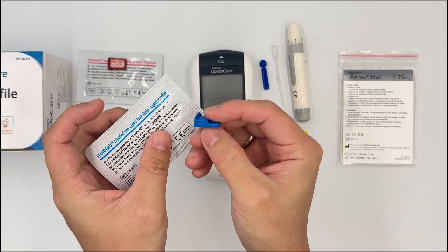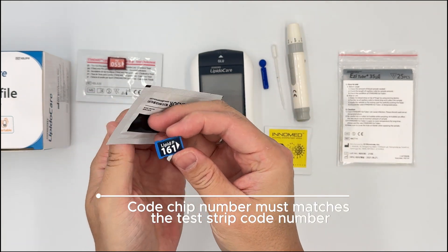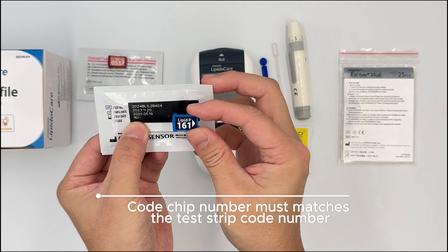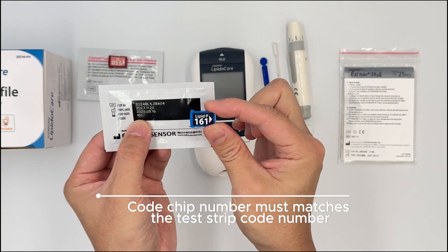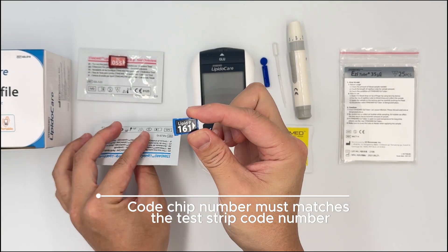What you want to do is make sure that the code chip number — like here, 161 — is the same number as the back of the strip, which is also 161. This is important because the code chip actually calibrates the meter to the lot of strips that you have, ensuring its accuracy.